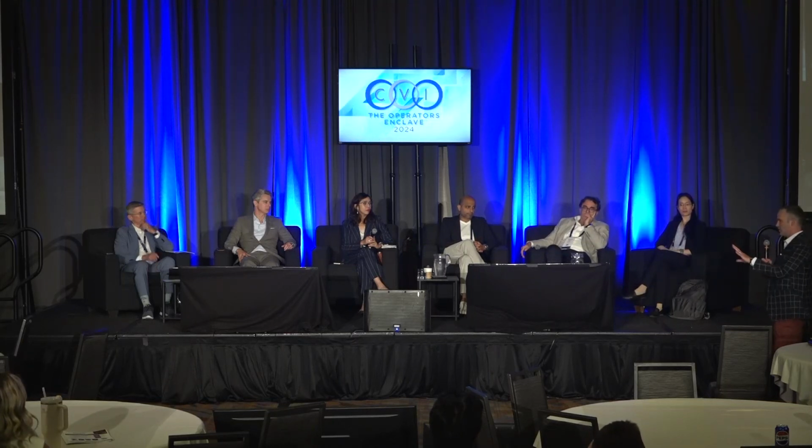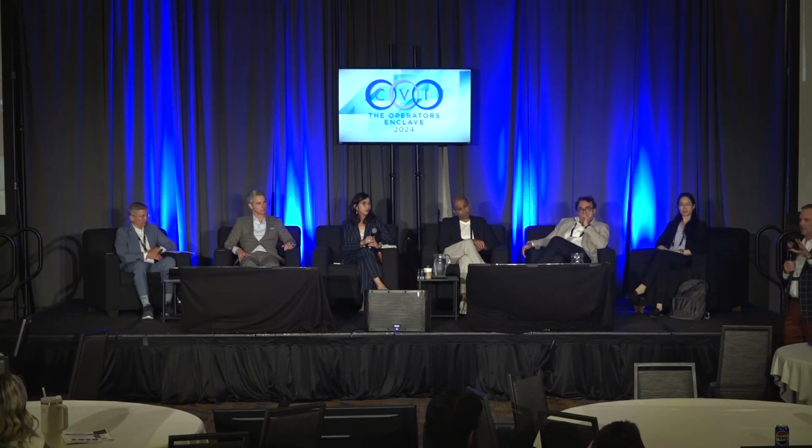I don't think there's a guarantee to that, of course, and that's also assuming that you've got great imaging that allows you to see your landing zone, that your approach angle is very straightforward. This is not one where you're going to have to do a lot of manipulation and counterclock just to really gain depth and get up into the appendage, et cetera. So I think in cases where the anatomy is straightforward, the approach is straightforward, the imaging is excellent, that's probably just as safe as something like this.